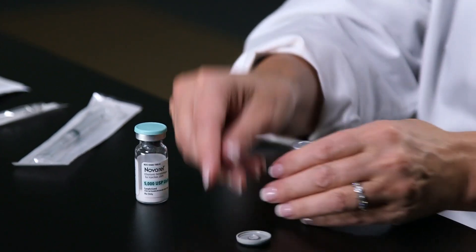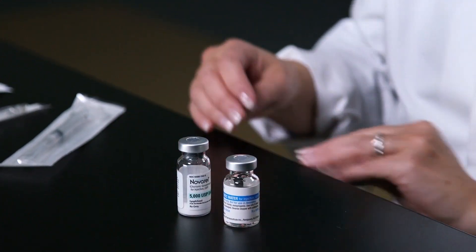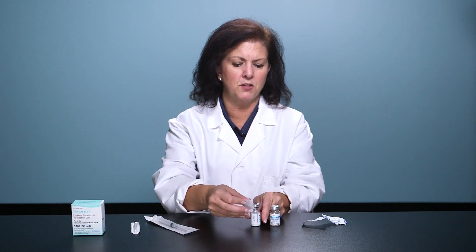Prior to mixing this medication, wash your hands thoroughly with soap and water and make sure you're using a nice clean surface. Alcohol wipe the tops of each vial.